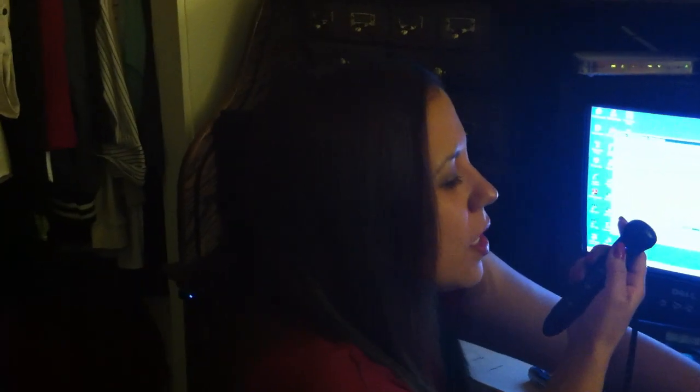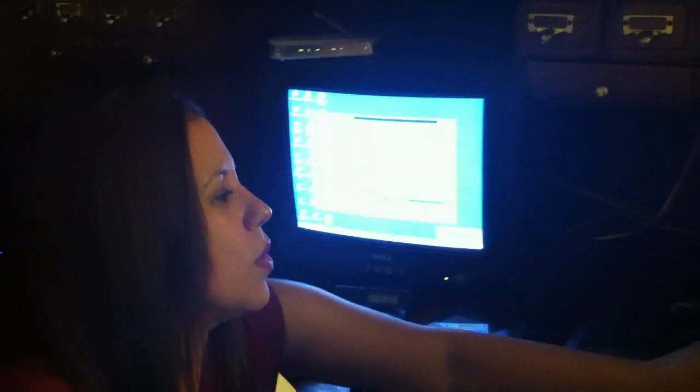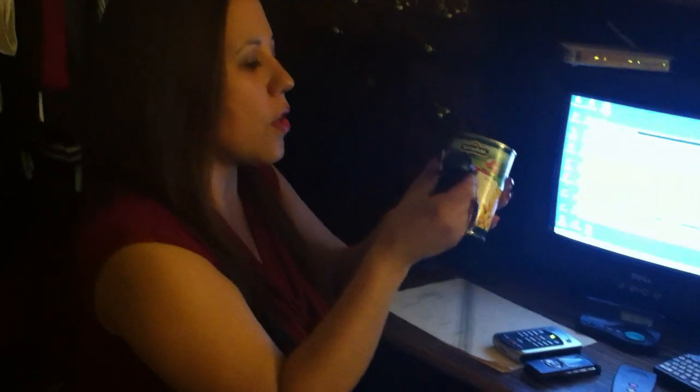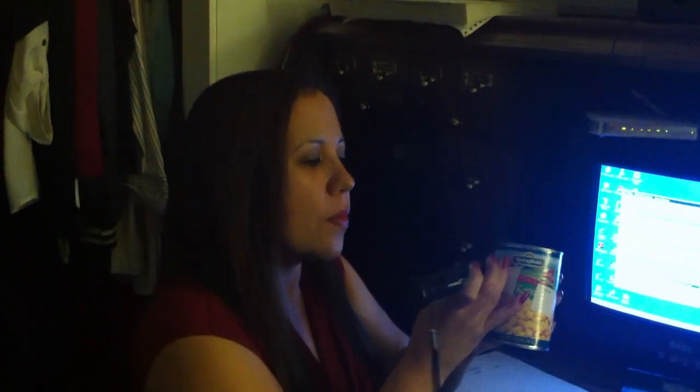Okay, it's not turning on. Anyways, this is something that is very helpful. It comes with stickers. Okay, now it's turning on. So it usually comes with these stickers, the little stickers. And what you do is you stick the, put the sticker on whatever. This is a can of corn, I was told. So what you do is you record the name of whatever you're going to label. Okay, a corn. Okay, so you record that and then you can just go back and read it. Okay, hopefully. So this is very helpful for someone that has low vision. I use it all the time and it's very helpful.